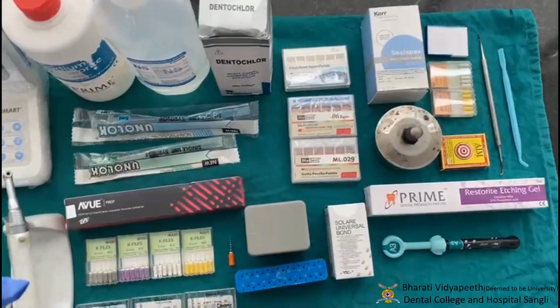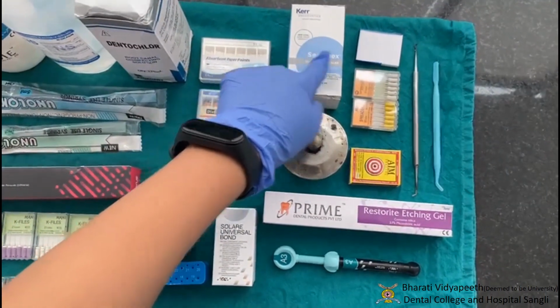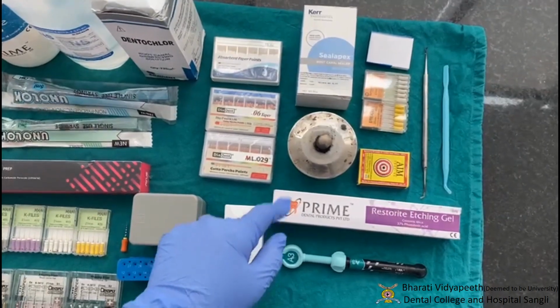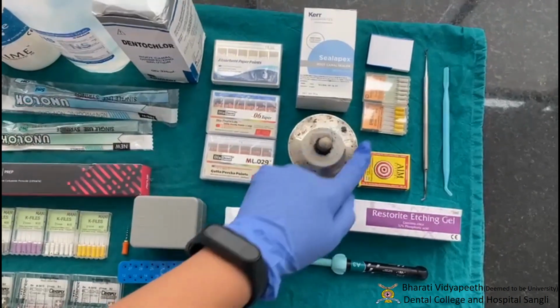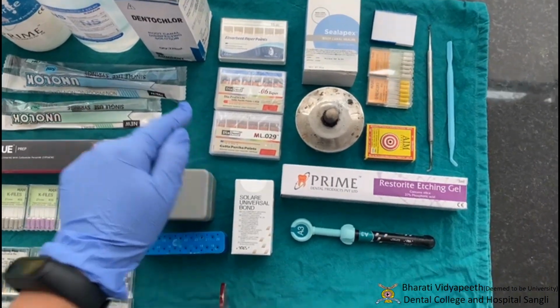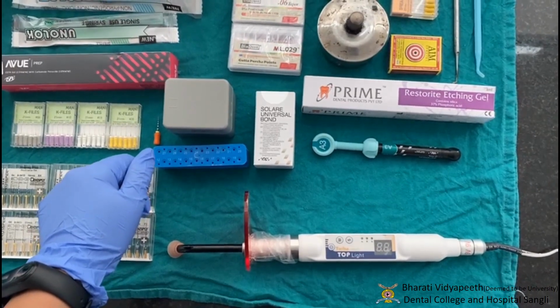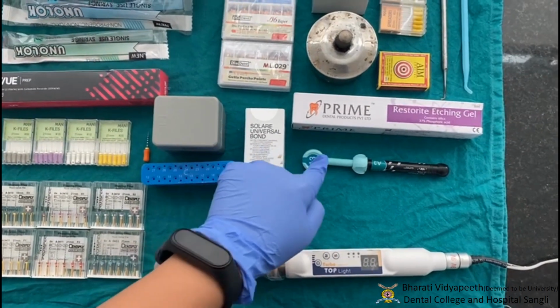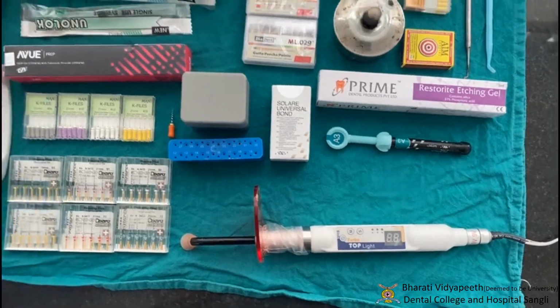After verifying the fit radiographically, we proceed to obturation, which is done with the help of sealer, which is mixed on a mixing pad with a spatula. Then obturation is done. For obturation, we require a spirit lamp, matchbox, spreaders, and gutta percha cones of various sizes. After obturation, post-endodontic restoration is done using composite, for which we require an etchant, bonding agent, and the composite. The composite is cured with the help of a light curing gun.